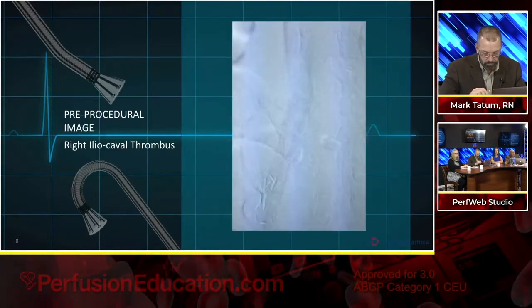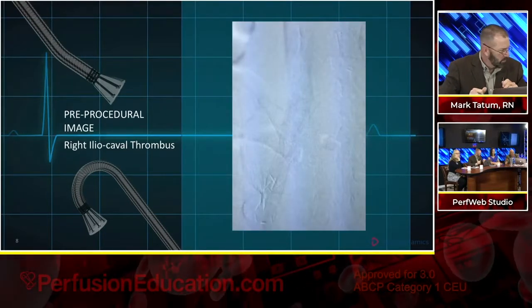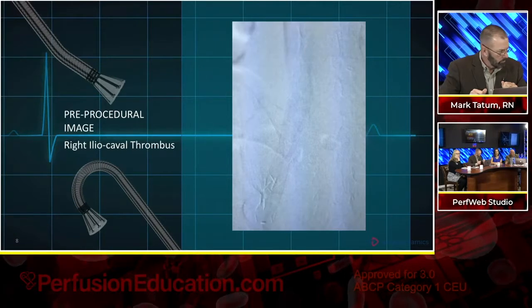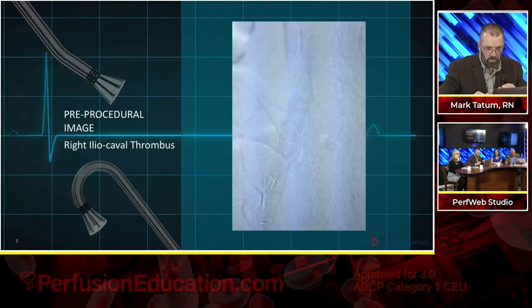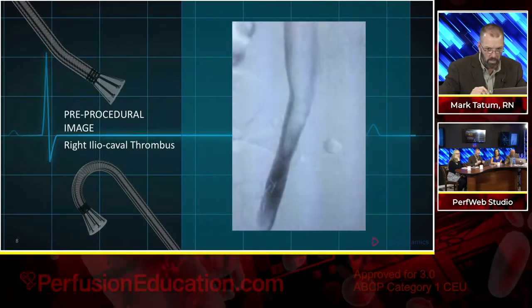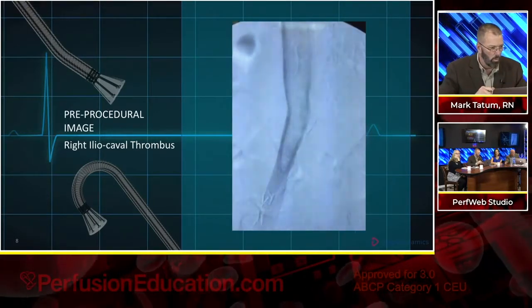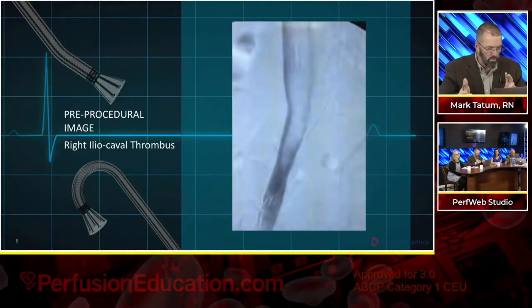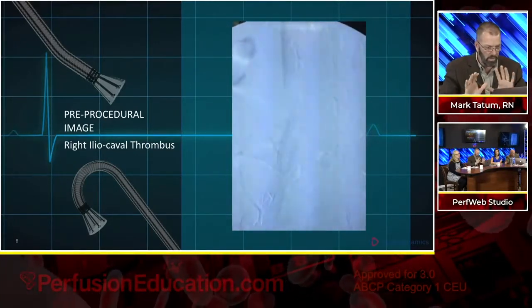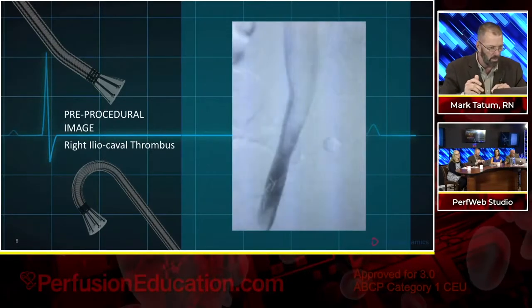Okay. So in this, now go to Slido, and this is where it's an active poll right now. Let's give one more click, and this will show the actual live image. There it is. So this is that patient. This is what we were looking at before. And what we can see is that we've got venography here. It looks like likely digital subtraction. So you've got that in the background where you can really, really see the contrast go through.